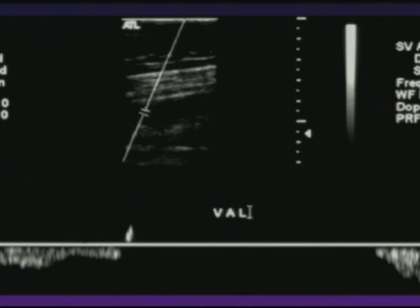We've demonstrated the findings of acute venous disease, scarring, and venous insufficiency. Thank you for your attention.